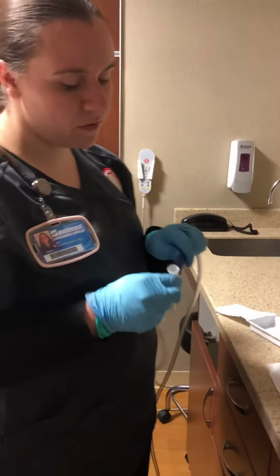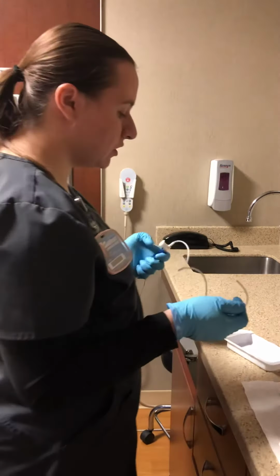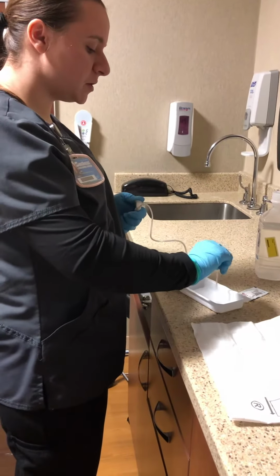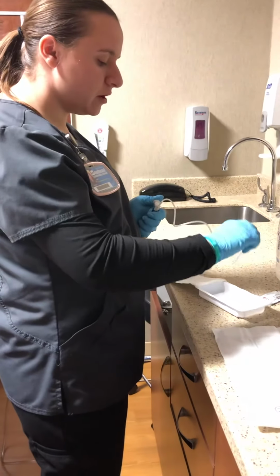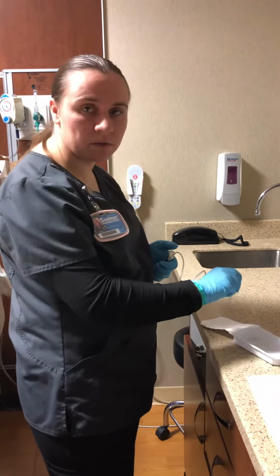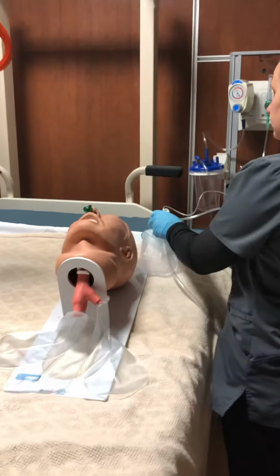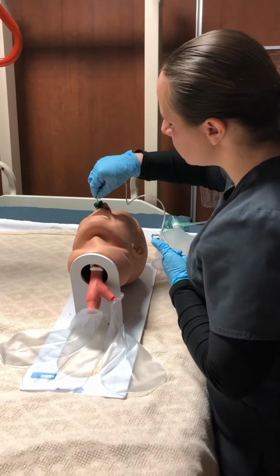And as soon as you have it connected, you start hearing a hissing sound. And when you're ready, you need to test it to make sure it's working properly. So you can suction up some sterile water, and that will also help get some sterile water into the tubing, and it'll make the secretions come out easier too. And so then we will lubricate the end piece, being very careful not to touch anything else, but placing it in the lubricant. And then when we are ready, we will remove our oxygen source, and then we'll go slowly into the patient's nose.